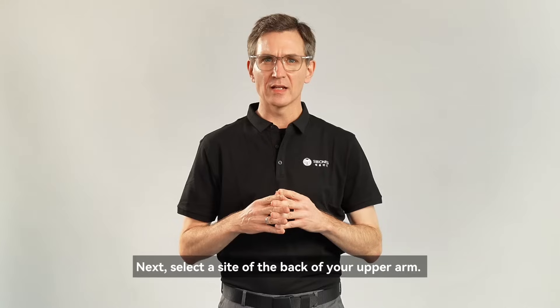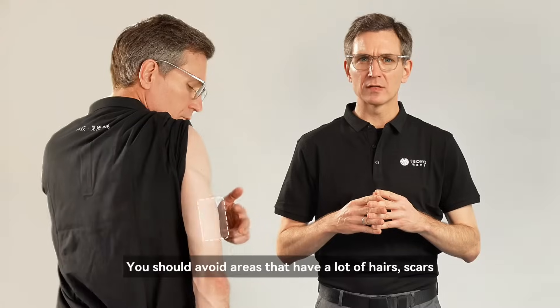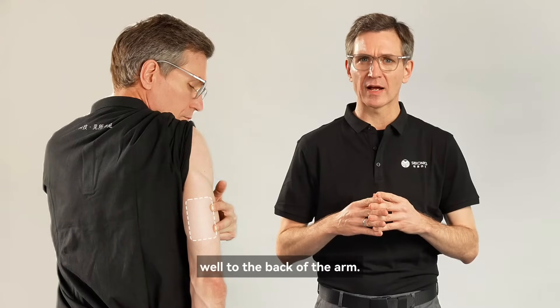Next, select a site on the back of your upper arm. You should avoid areas that have a lot of hairs, scars, moles or lumps to ensure the sensor sticks well to the back of the arm.